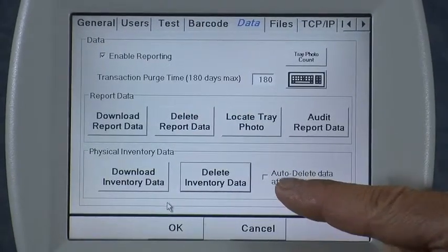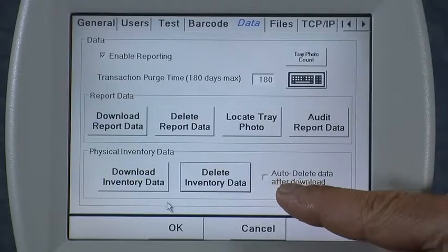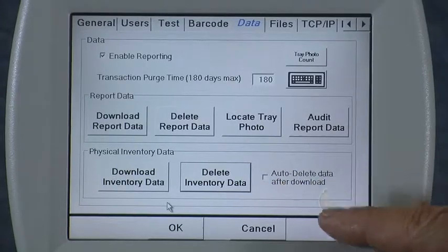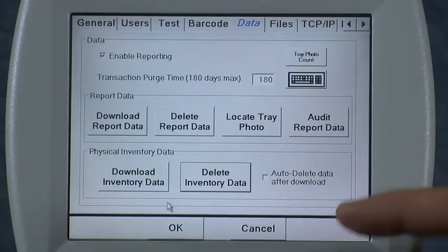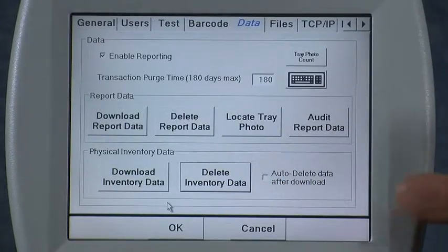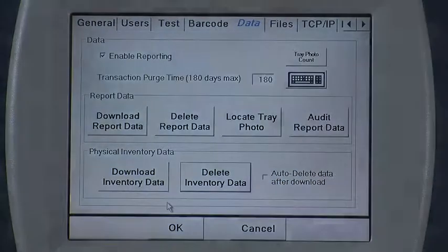And lastly, there's a checkbox to allow the icon to automatically delete the data after performing the download feature.